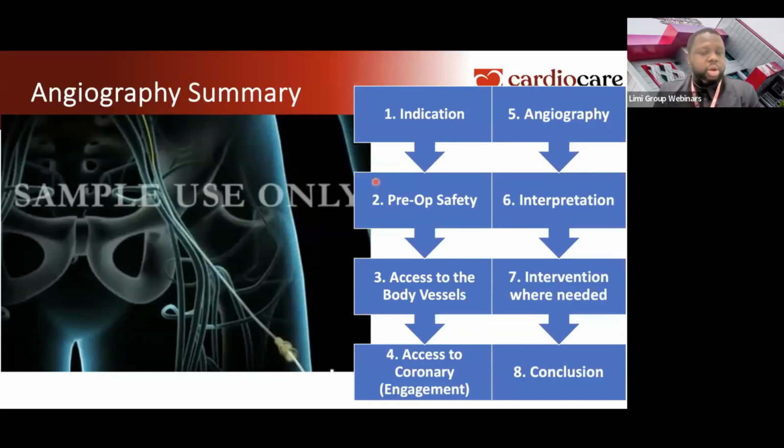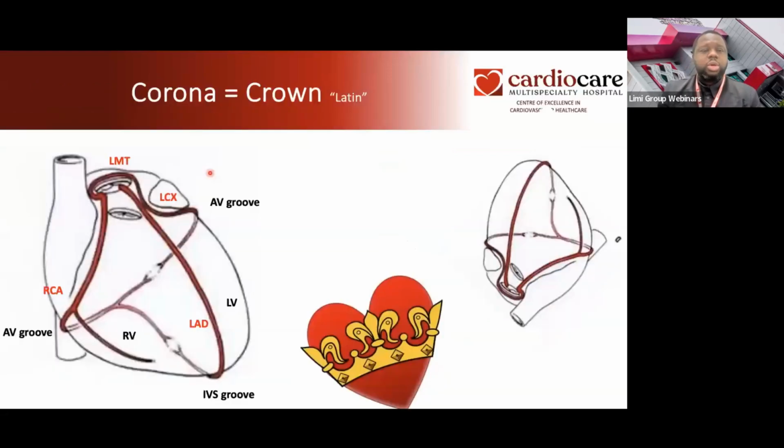There are a number of things that happen in conclusion, including discussing with the patient and the family, doing a brief looking at what has happened, going through and maintaining hemostasis so that there's no bleeding, and so on and so forth, and then giving the patient appropriate instructions.